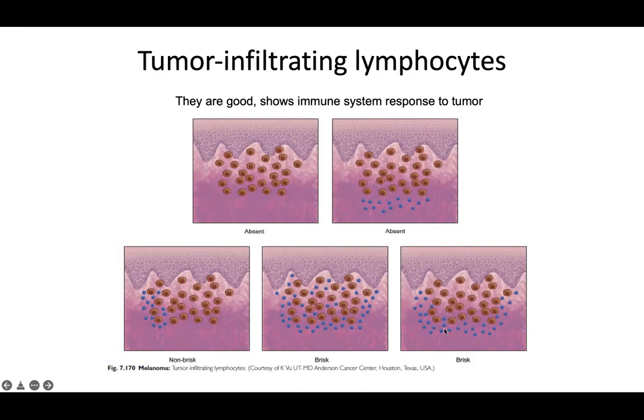And if you have even just some infiltration on the outer edges of the tumor and it's kind of spread throughout, some people would argue that that's also brisk. It can be a little bit subjective, again, also depending on the sectioning. But again, this is oftentimes a supplementary aspect of a synoptic report, and I try to include it if I can assess it.